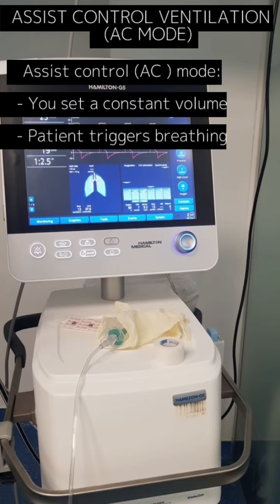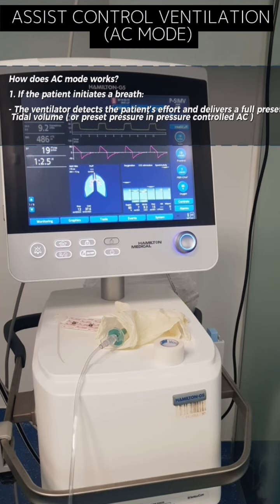Let's talk about assist control mode, or AC mode. AC mode is a ventilation mode where the ventilator provides full support for every breath, whether the breath is initiated by the patient or by the ventilator. So how does AC mode work?